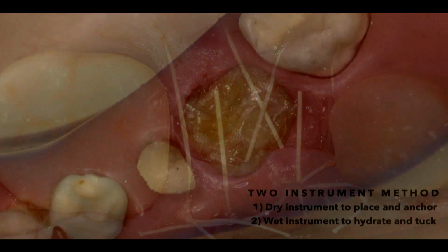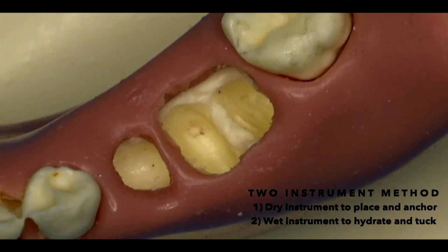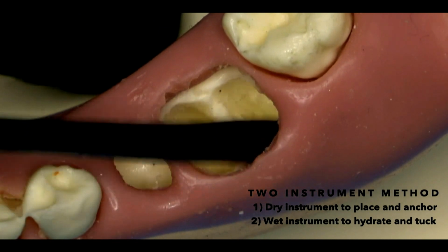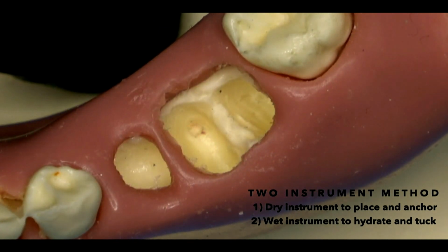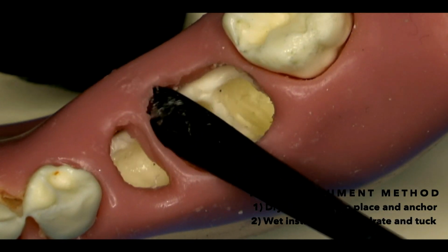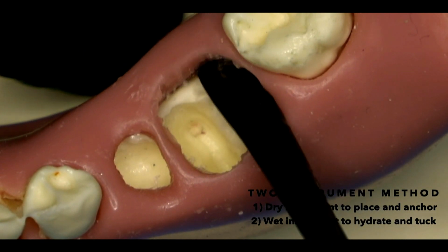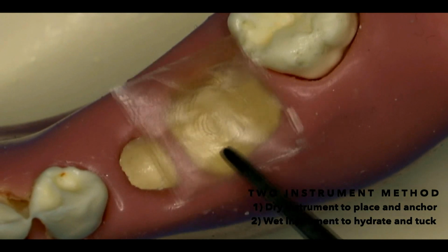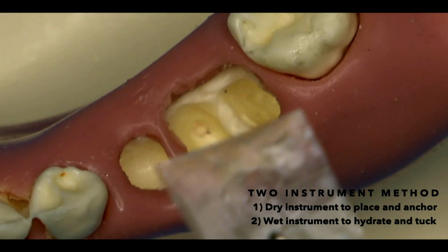And I will have the BioXclude basically just sitting over that bone graft without having to raise large flaps to get that BioXclude tucked in. And again, that's the benefit of the handling properties of this material. And so this little video just shows, in a case like I just presented, we'll just gently elevate the marginal tissue 1 to 2 millimeters.